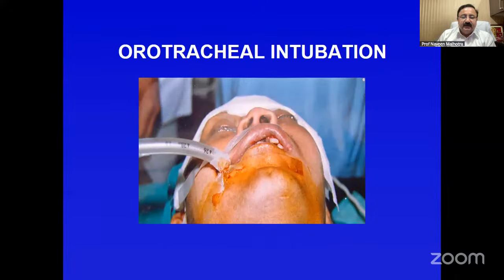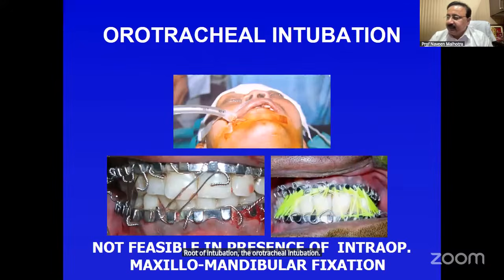We all understand that this is the standard route of intubation, the orotracheal intubation. But if we have to do intraoperative maxillomandibular fixation, then orotracheal intubation becomes impractical. Earlier, it used to be done by wires, and now it is done by high tensile elastic bands.